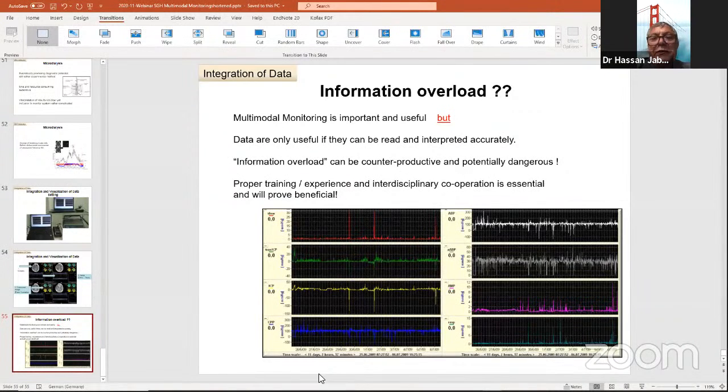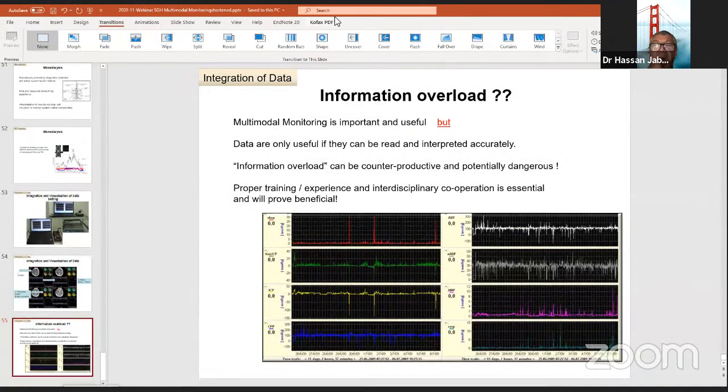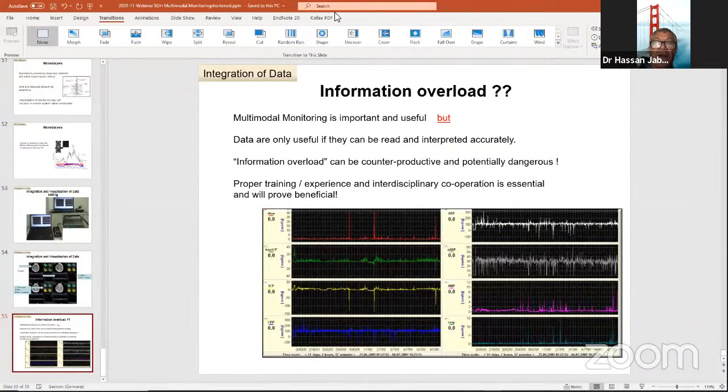Okay, thank you very much, Professor Jorn. Professor, I have three or four questions about the lecture, about the monitoring. The first one is that the ICP is more or less homogeneous in the brain, wherever you put the ICP. There is, sometimes, some variation.